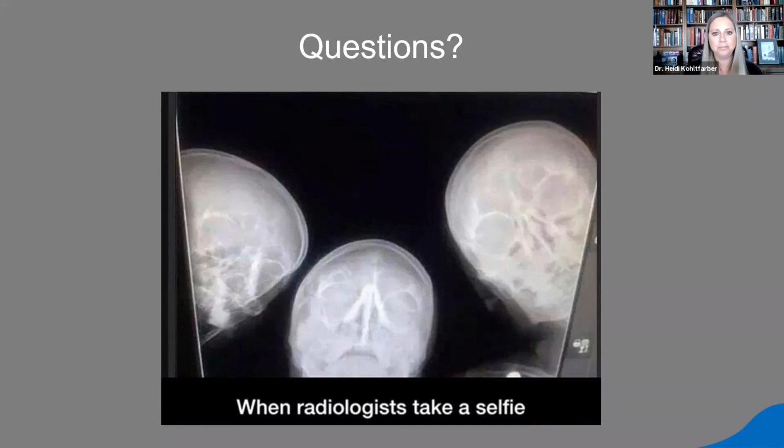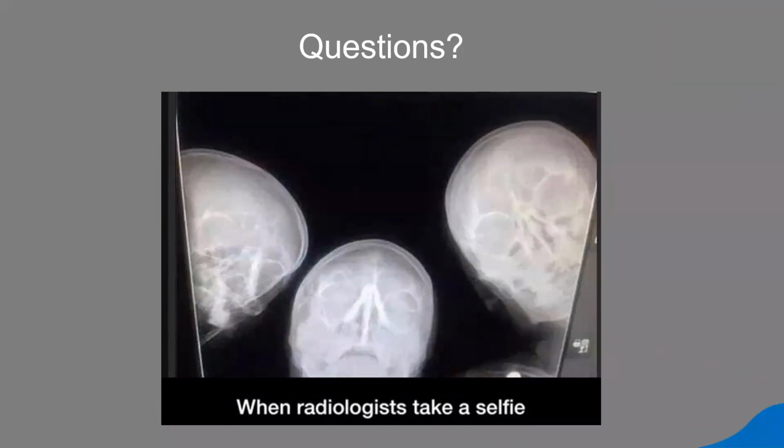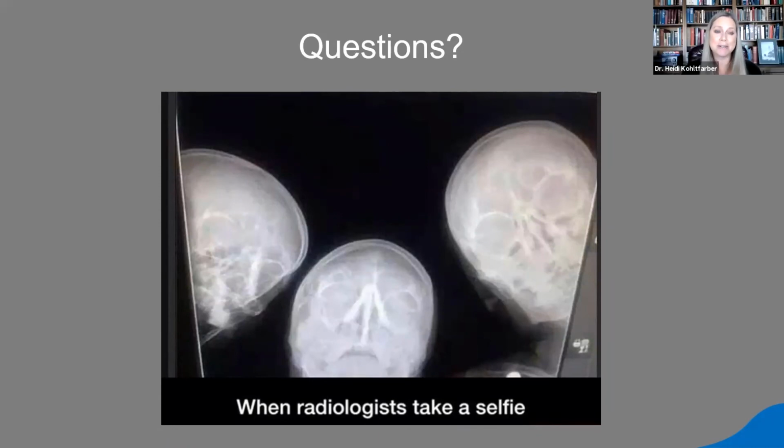All right. Another good question here. Is it standard of care to have CBCT in the office? That's an excellent question, and a hard one to answer, because from a radiological standpoint, we always want to promote selection criteria. We never want to say standard of care per se. But there are position papers out there. One came from the American Academy of Oral and Maxillofacial Radiology in conjunction with dental implantology in 2012, and it recommended 3D imaging for all implant site assessments, with CBCT as the imaging method of choice.